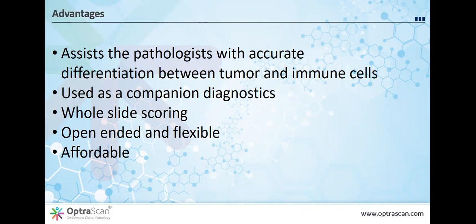It's a big problem with the FDA and with other approval agencies too, when they look at the results and try to understand what the issues are for pathologists. And there's a lot of concern that if the quality of the scan isn't good enough, the pathologist might get it wrong.